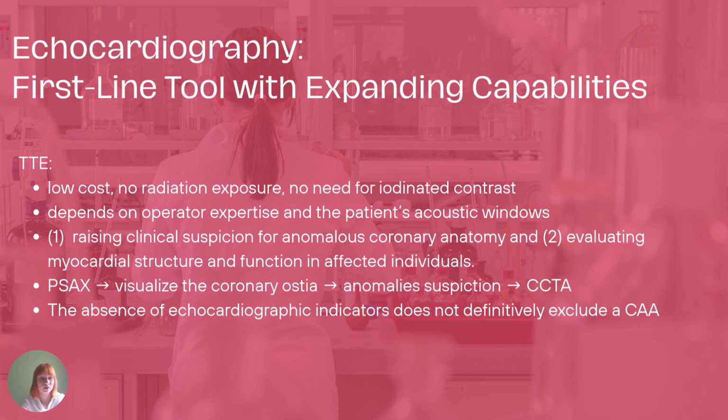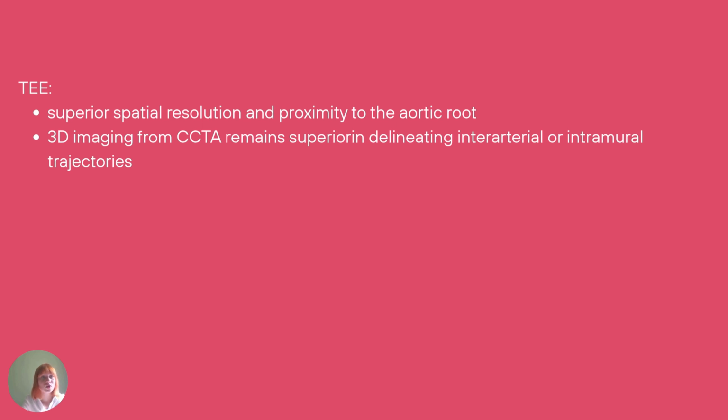And what is important, absence of any signs or indicators of coronary artery anomaly does not definitely exclude it. Of course, transesophageal echocardiography is also a method of imaging.